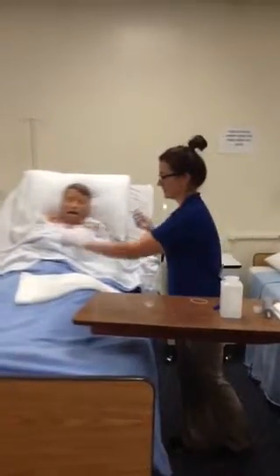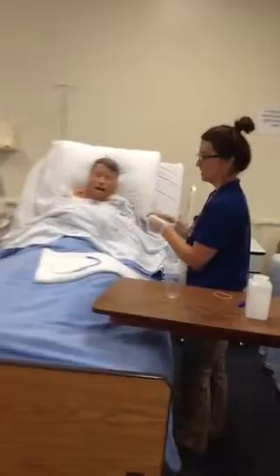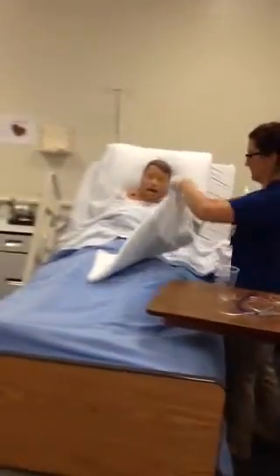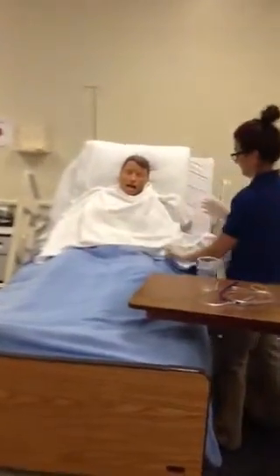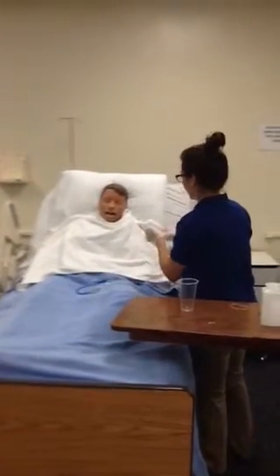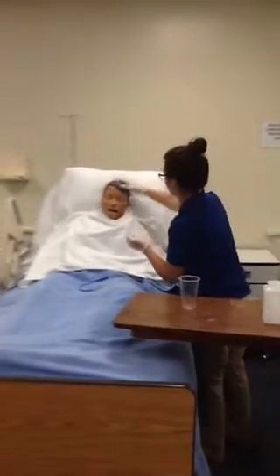And I would let Mr. Wilson know that the procedure is about to begin. And also, I need to put the towel on him first. Okay. All right, Mr. Wilson, I am going to begin advancing the NG tube. Will you please make sure your head is against the pillow and look up a little bit for me?